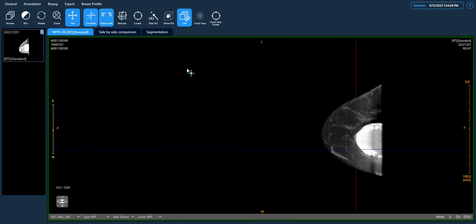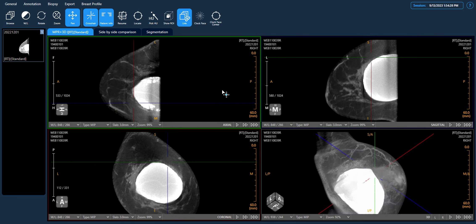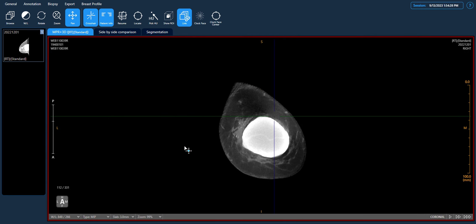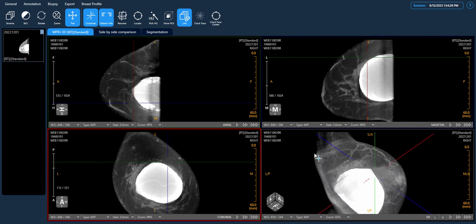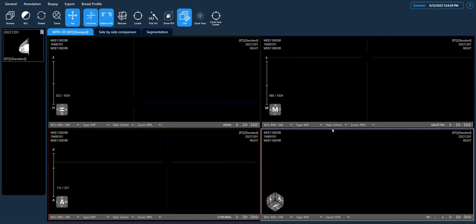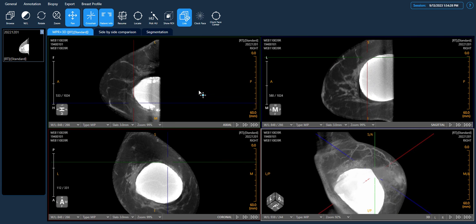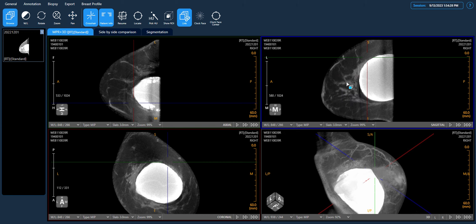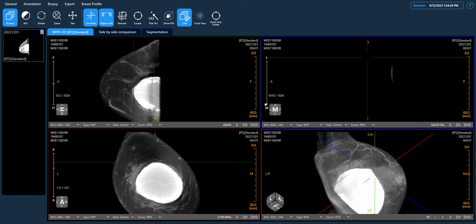We can double-click any plane to expand that view to full screen. We begin the image review by selecting a preferred view, for example the sagittal view. We can make necessary adjustments with the tools provided by the viewer, and use the Browse tool to start browsing from medial to lateral.